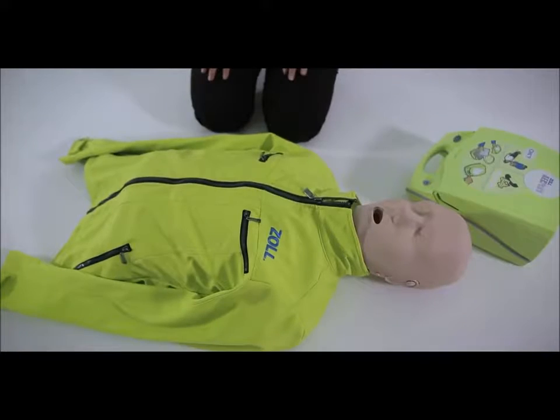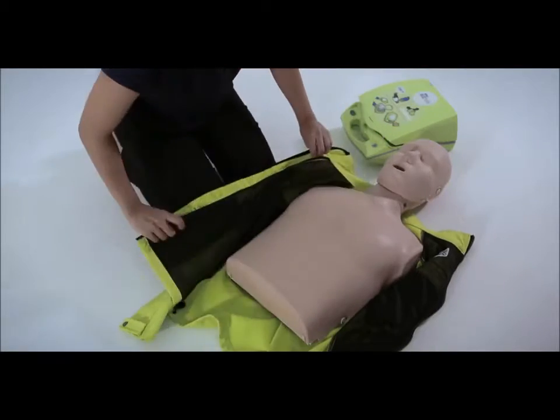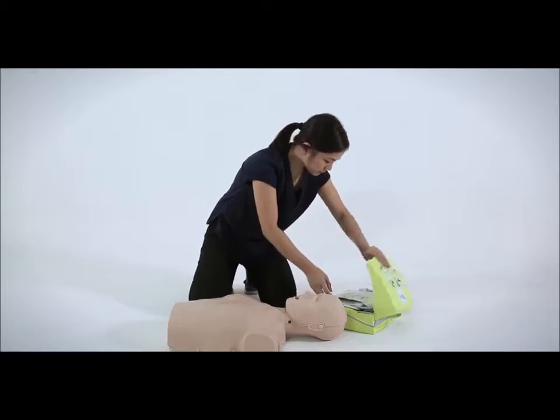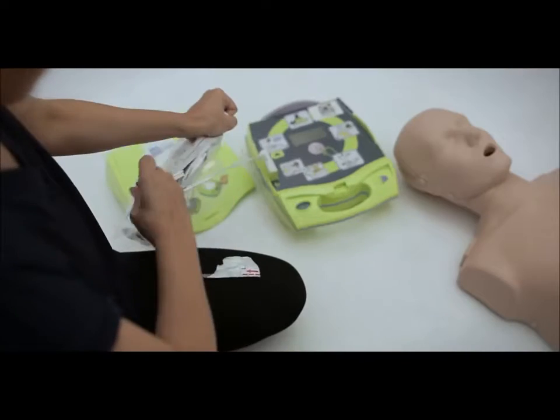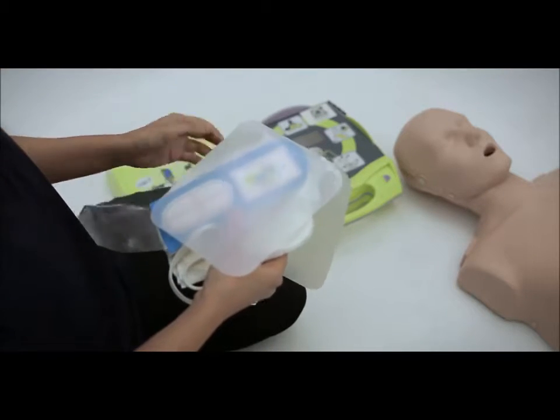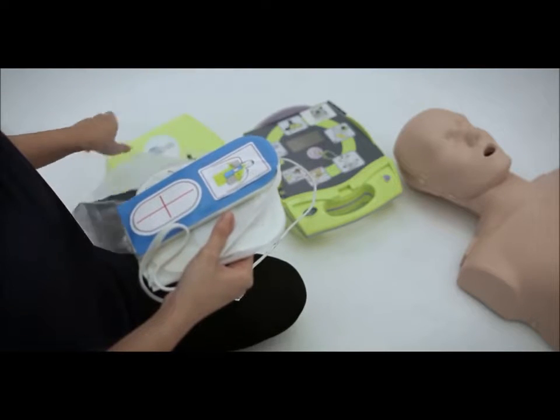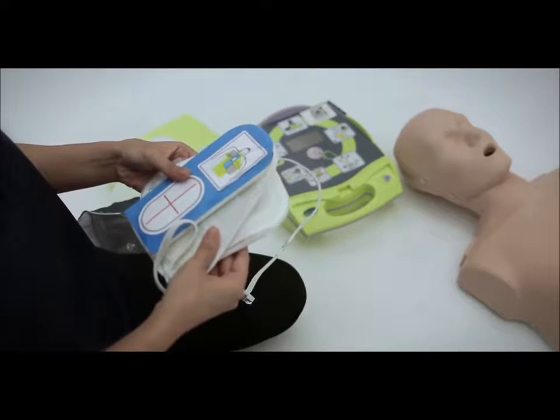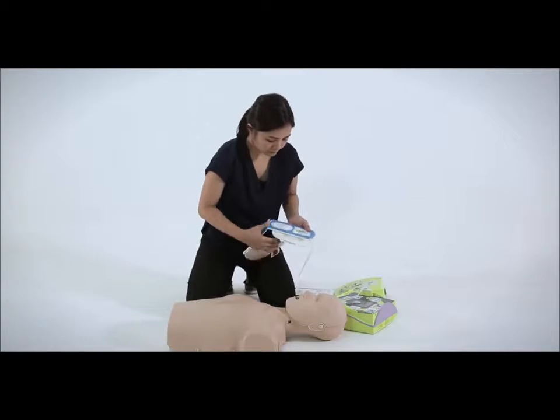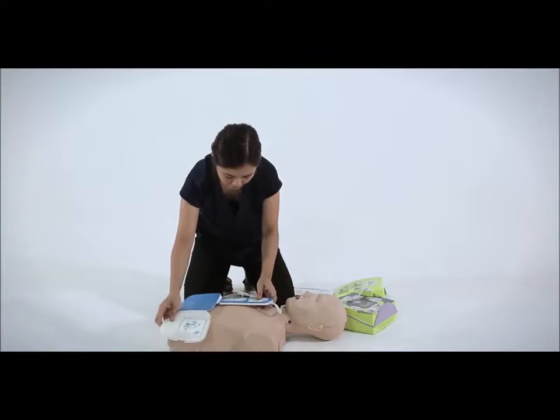Call for help. Remember to remove the victim's clothes to expose his or her bare chest before attaching the electrode pads. Tear open the electrode pack and unfold the electrode pads. This is an electrode pad intended for adults. Some electrode pads, such as the one used here, are one-piece pads designed for easy placement. Using the plus sign on the CPR sensor to guide you, place the CPR sensor in the middle of the chest, in between the nipple line.